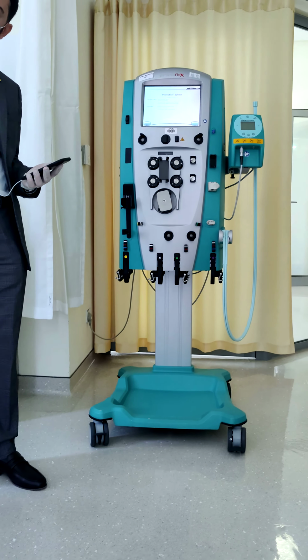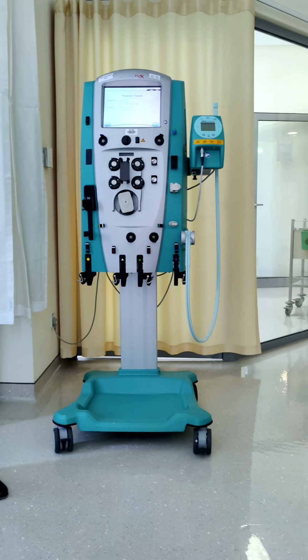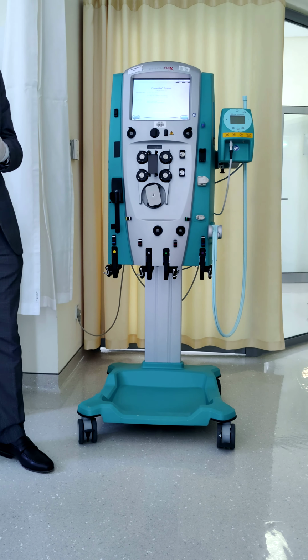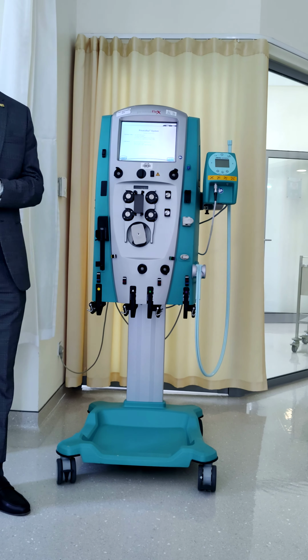If I need more, a rate of more than 100%, I have to increase this value accordingly. 3,640. Okay, this is about the calculation.